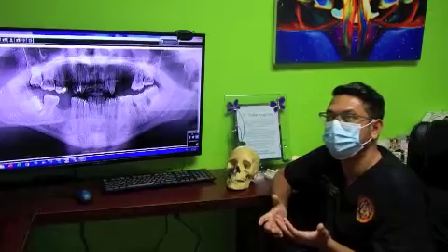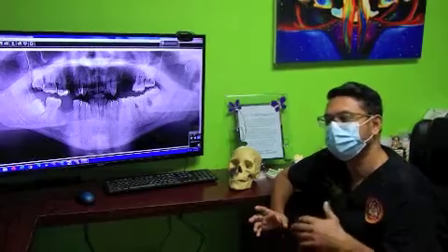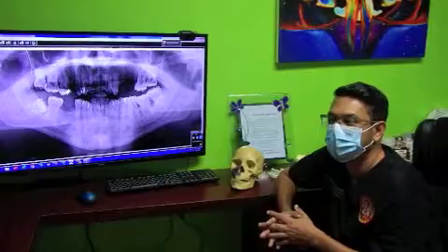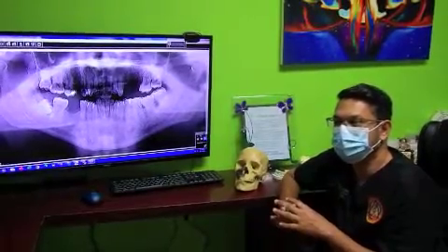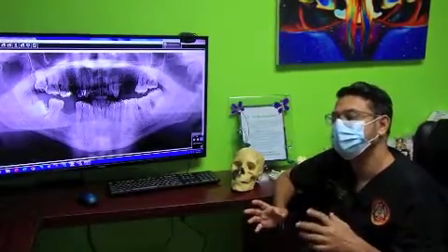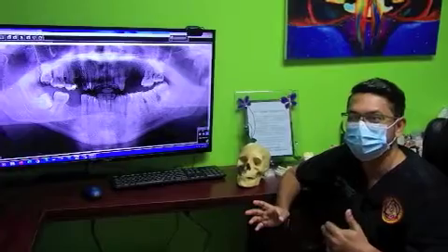For example, a patient may come in with a fractured filling or fractured tooth, and it's easy to take a periapical x-ray and just zone in on that issue, and you tend to that, and you may do an excellent job at managing that particular issue. But unless you take into consideration the whole context of the patient's mouth, you may be doing your patient a disservice, because you have to ask searching questions. Why did this tooth fracture? Why did the filling fracture? And oftentimes it goes right back to occlusion.